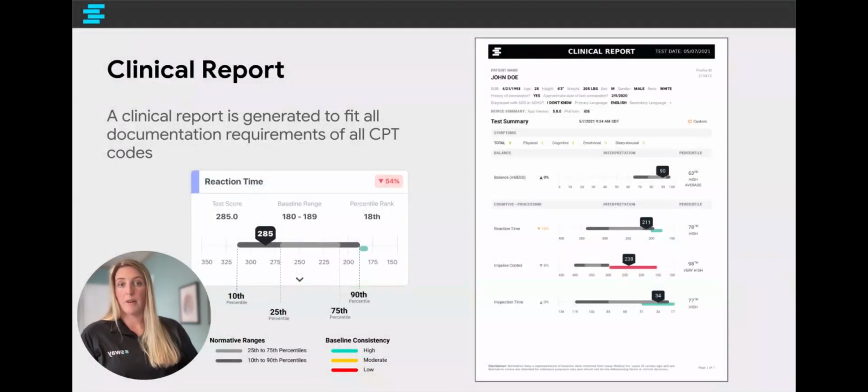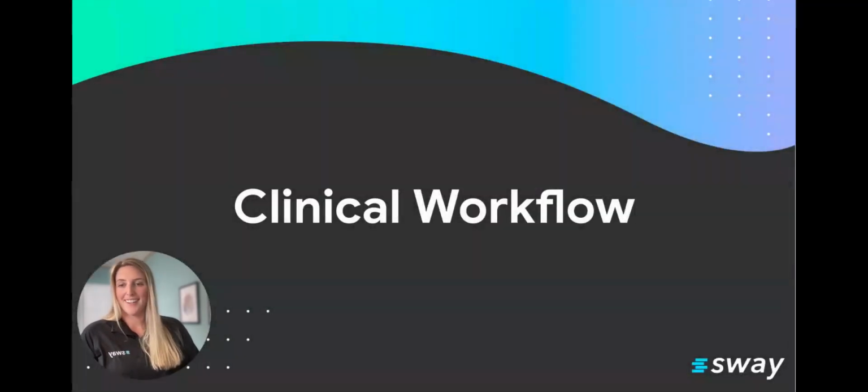With every Sway test, no matter what type of patient you do it on or how many modules you choose to administer, there's always going to be a clinical report that can be downloaded into a PDF. And that's something that you might need for some documentation, and you could also attach to the medical record. And we'll talk through that in some of our upcoming sections.